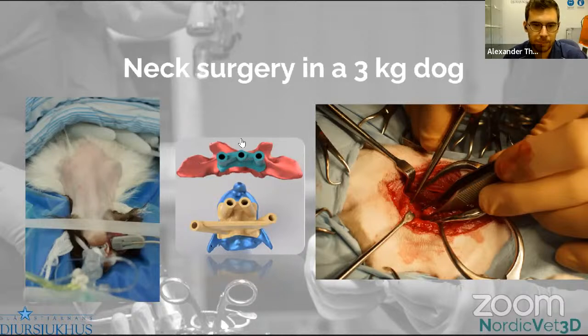So we wanted to stabilize them to each other, and in this case it was so evident that this technique is really good for small patients or for small structures, because we planned to put in 0.9 millimeter pins, and it's really precise when we put them in.